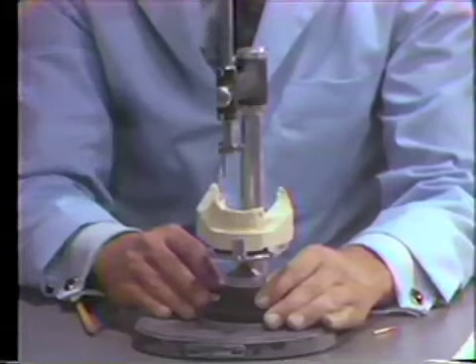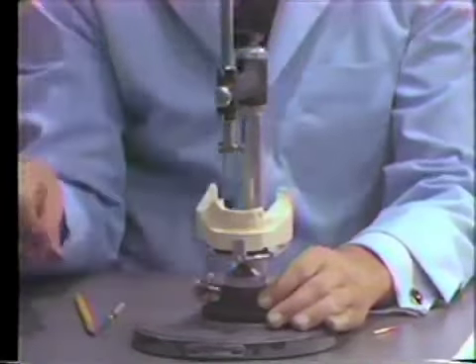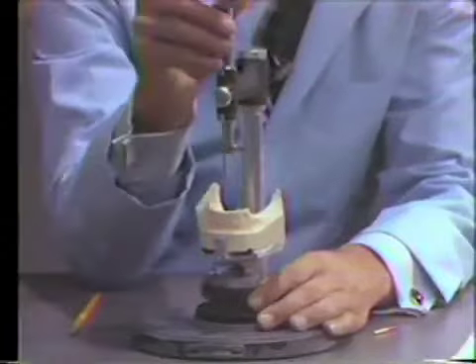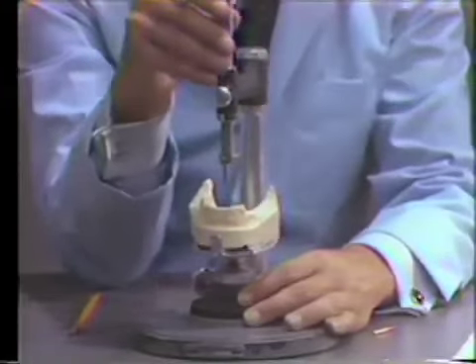So now I know exactly where I'll have to block out, or where I would either have to block out or alter the existing curvature of the tooth in order to get the partial denture in position. Now, the one last thing that I'm going to do is to tripod this case.